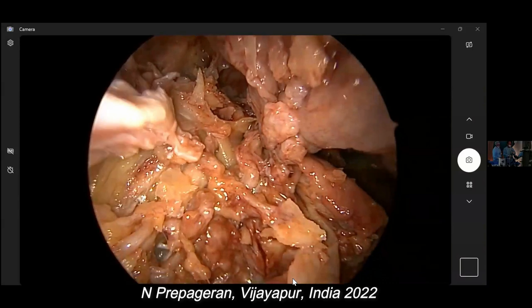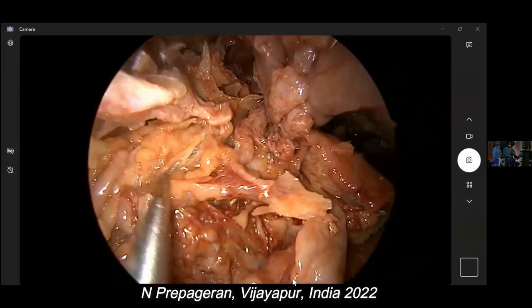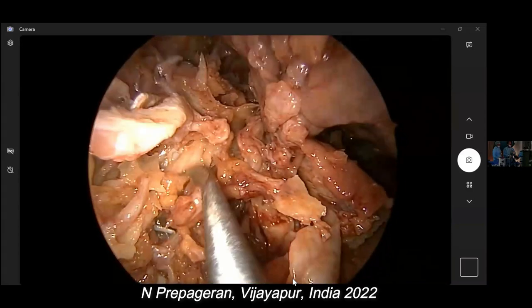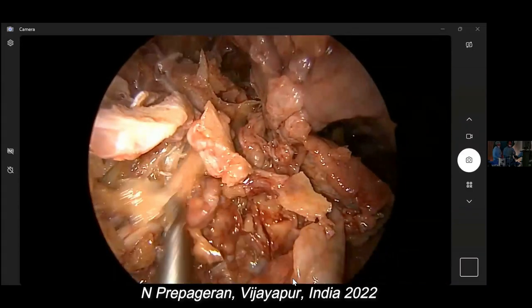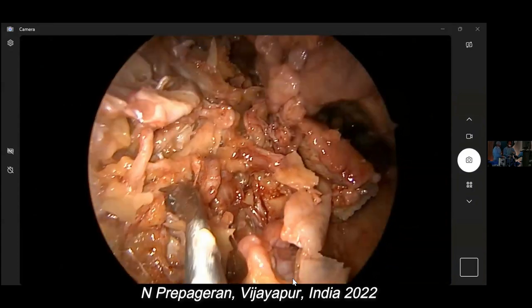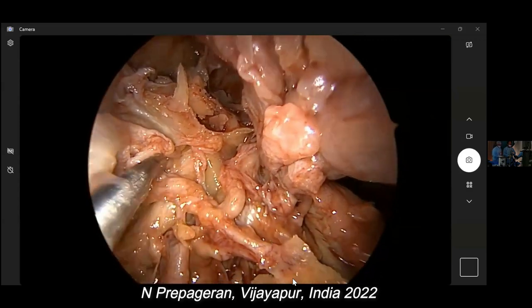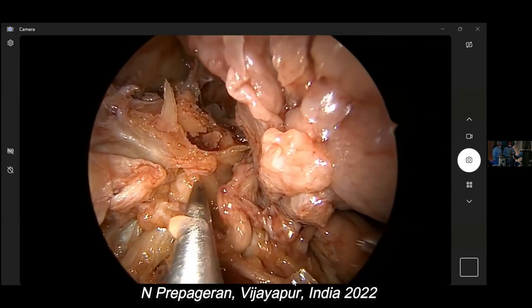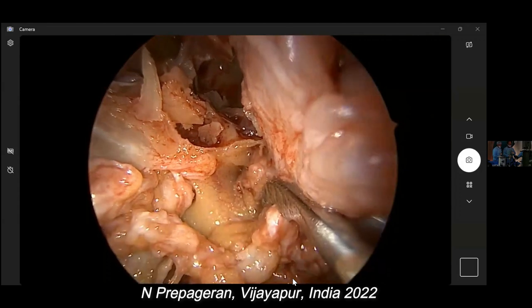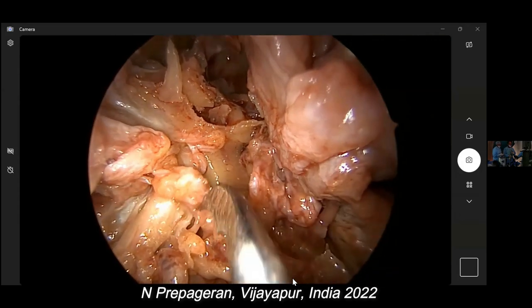There, the V2. Can you see the V2 now? How the V2 is going inside to form the foramen rotundum? There. It's V2, right? All agree? Coming from the orbit, going inside, and entering the foramen rotundum. Yes, sir. Seen. Clear. Foramen rotundum, Vidian nerve. Correct?